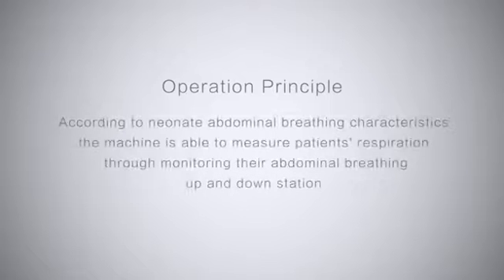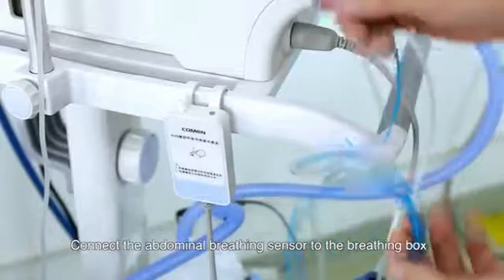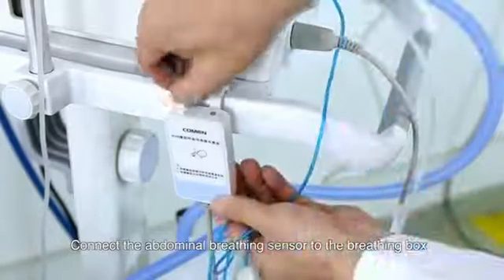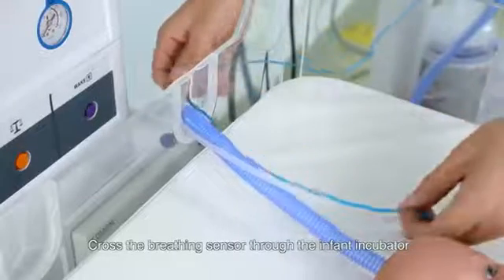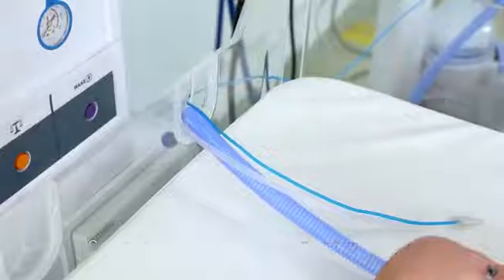Connect the abdominal respiratory sensor. Operation principle: according to neonate abdominal breathing characteristics, the machine is able to measure the patient's respiration by monitoring their abdominal breathing up and down status. Connect the abdominal breathing sensor to the breathing box. Cross the breathing sensor through the infant incubator.